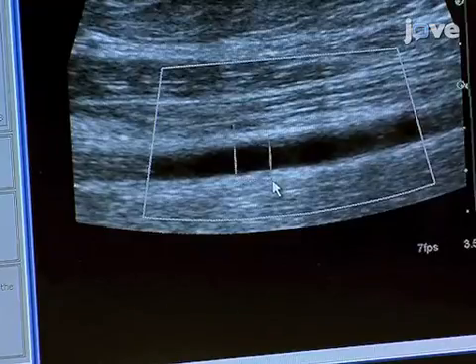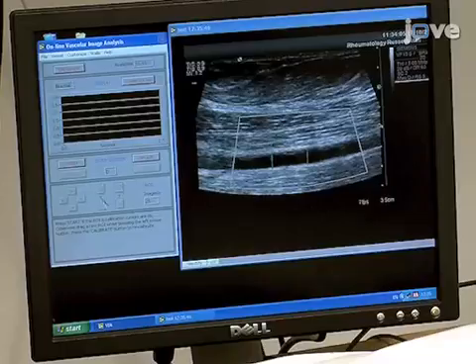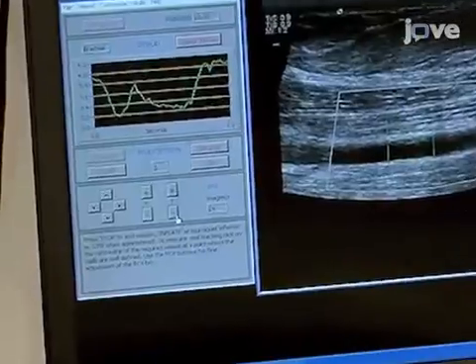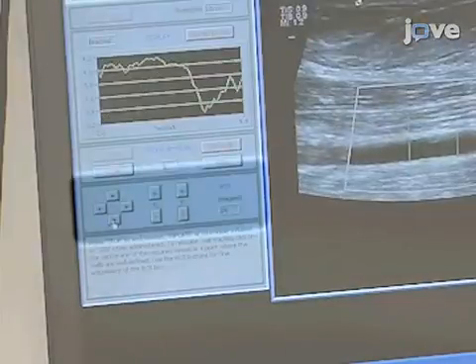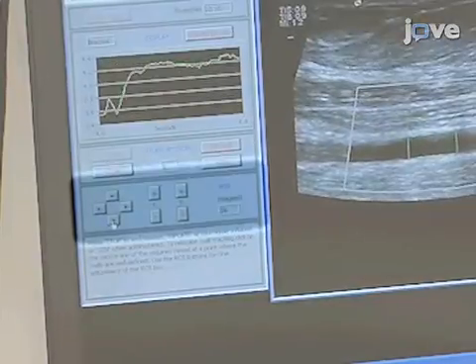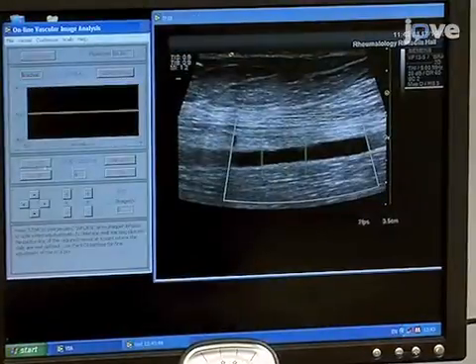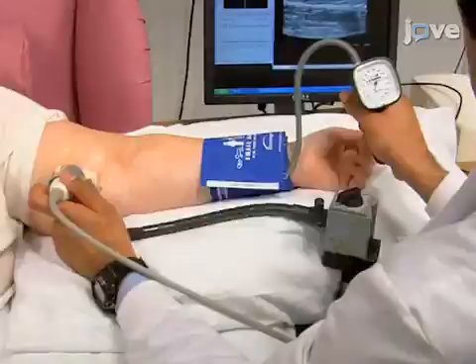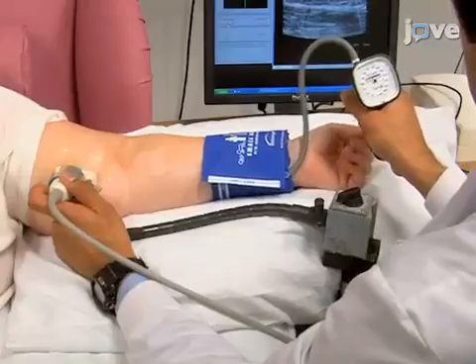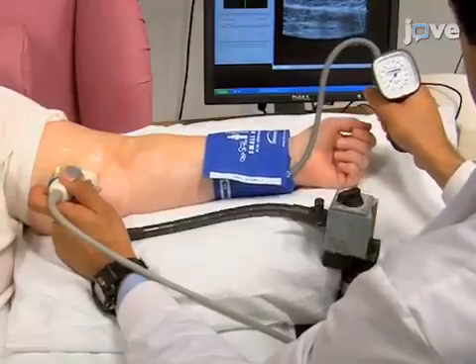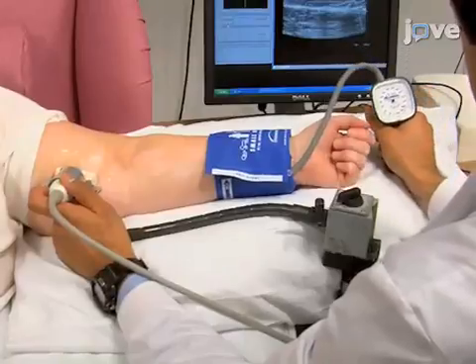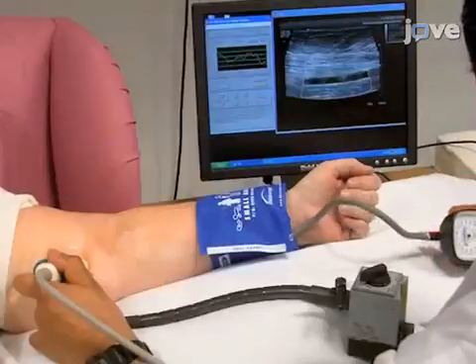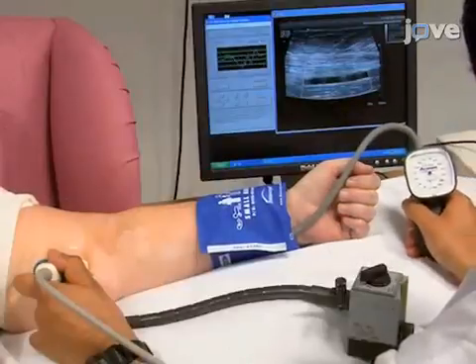In the software, use the cursor to mark the region of interest and the VIA software will automatically record the vessel diameter. Adjustment of the area can be done with the X and Y buttons on the main screen. Now click the start button and image the artery for 2 minutes. Then press inflate to record for 5 minutes while inflating the blood pressure cuff to suprasystolic pressures — blood flow to the hand should be occluded by the cuff. After the cuff deflates, continue recording for 3 minutes.